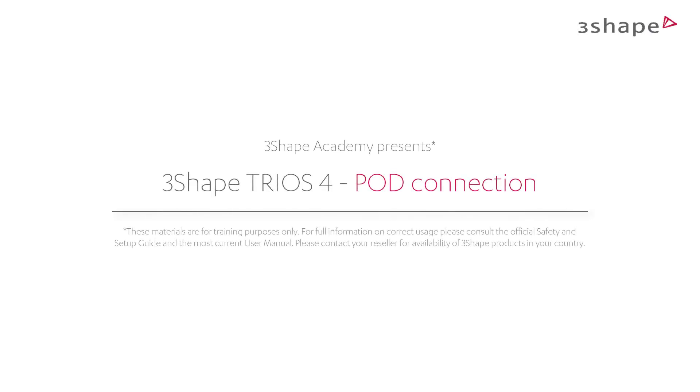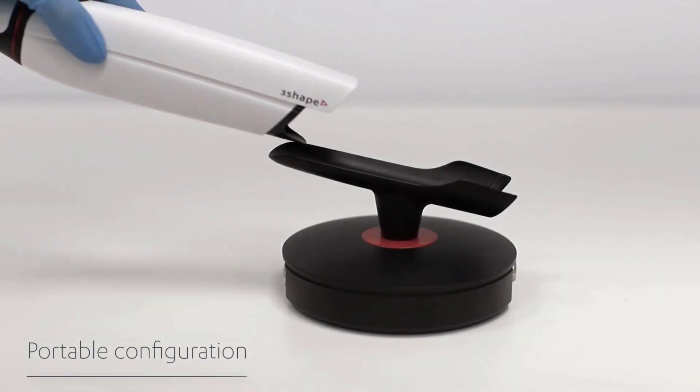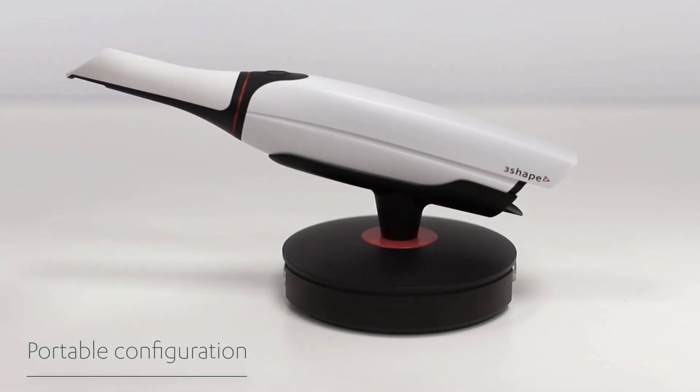In this video you'll learn how to connect the TRIOS pod. The TRIOS pod is 3Shape's mobile and flexible solution — for example, for dentists working in multiple locations or for clinics with limited space.